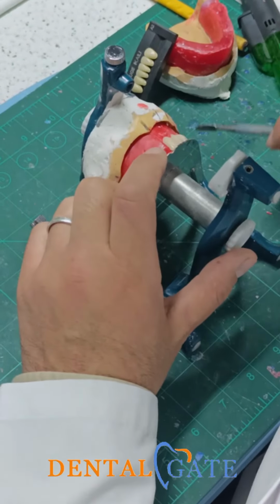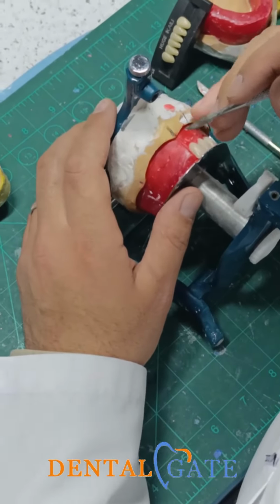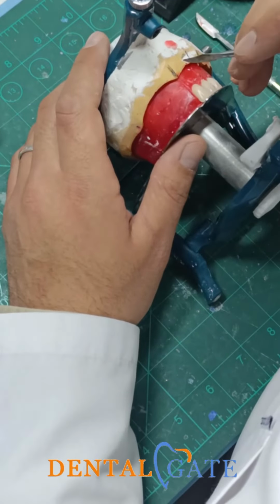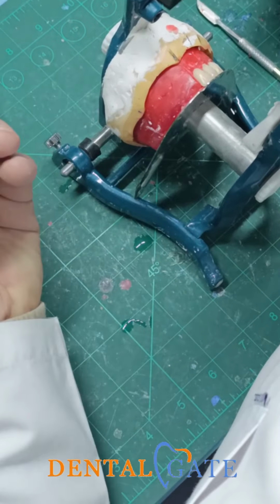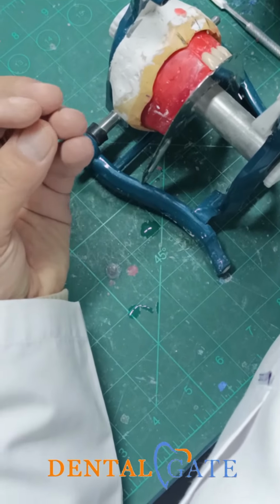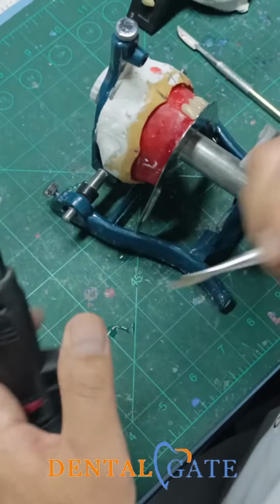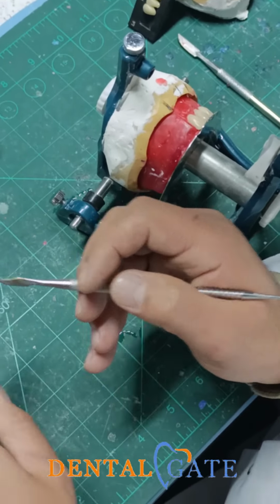The central incisor on the other side. For some criteria, I will remove a sufficient amount of wax. If you had an incorrect bite, trim and correct it, you can also do it with the handpiece. But my recommendation is to start with the small size of the teeth. This is fundamental for complete dentures. So I can remove a sufficient amount of the wax, and I already have the midline.